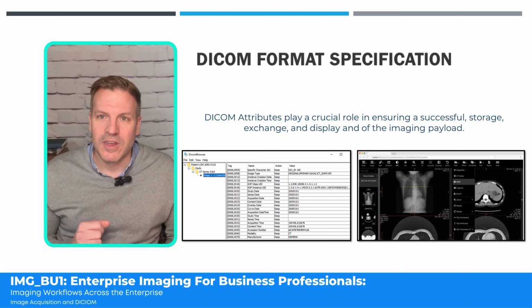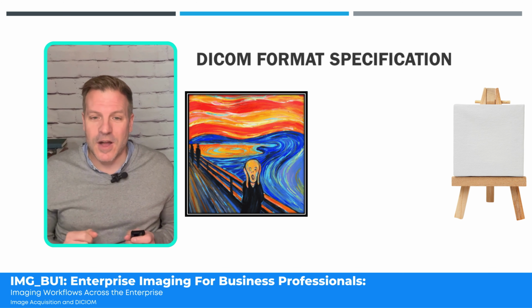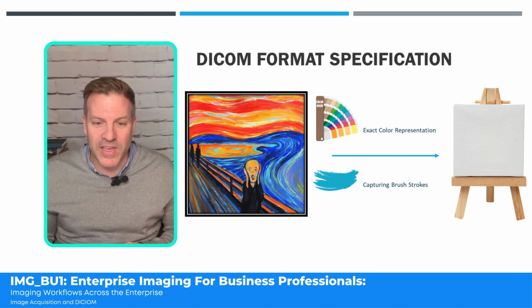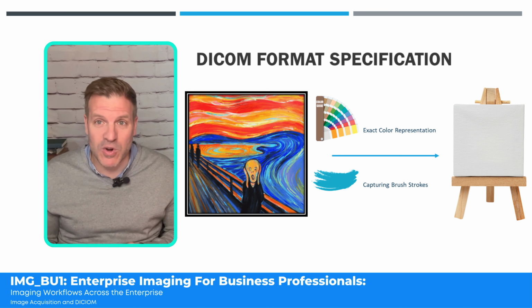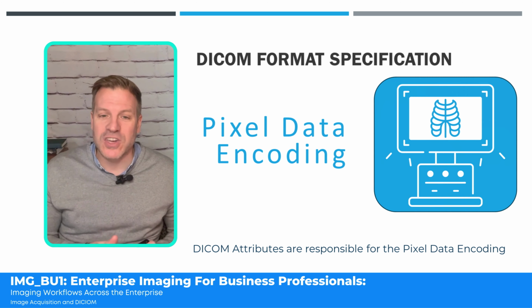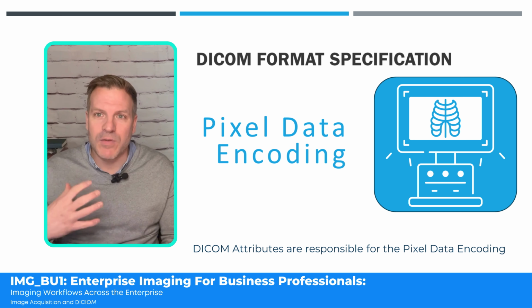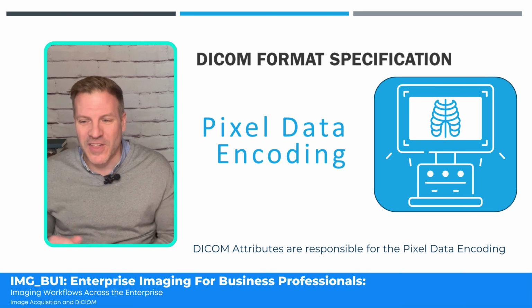imaging payload. Now, if I wanted to recreate or remaster an original painting, so I have the screen here, and I want to make a copy of this as closely as I can, I would be looking for things like what were the exact color representations that were used? How were the brush strokes? And I want to be able to copy those. Now, when it comes to DICOM, these DICOM attributes are responsible for pixel data encoding in that same way. So the attributes are going to allow us to get all that information that we need so we can recreate this medical imaging masterpiece on the other side.